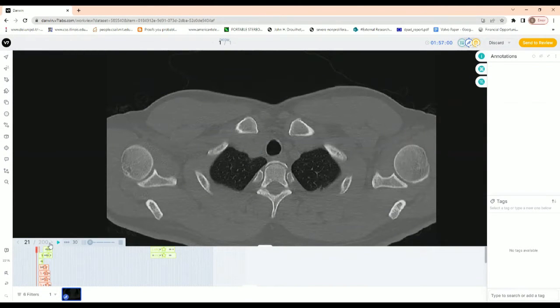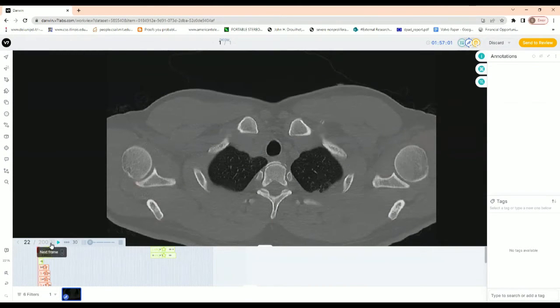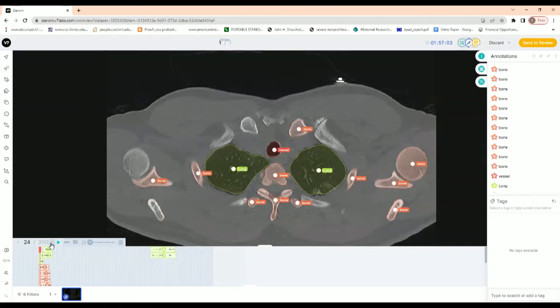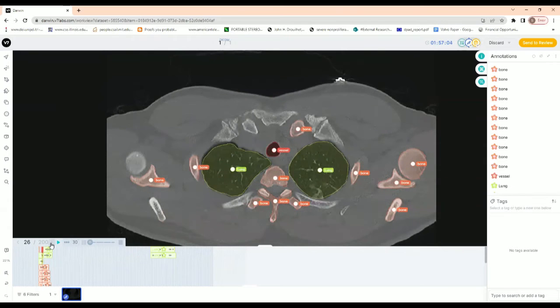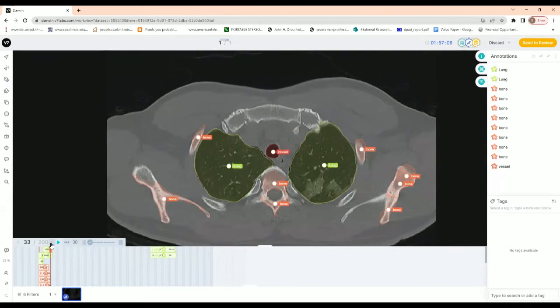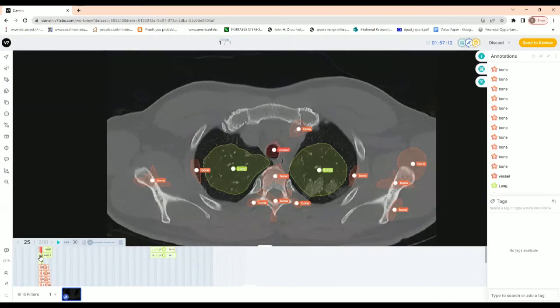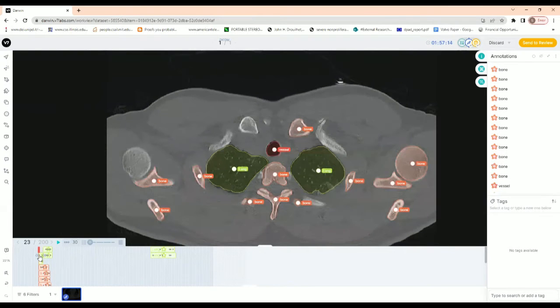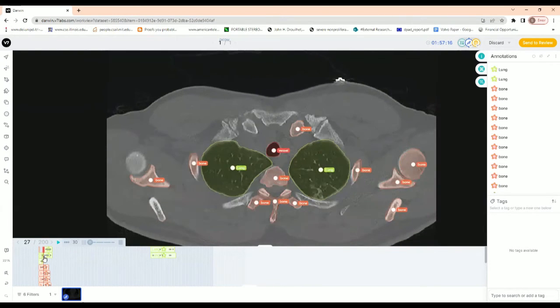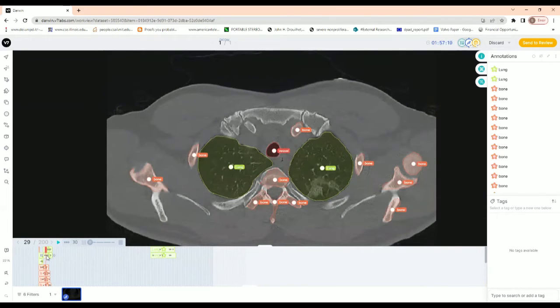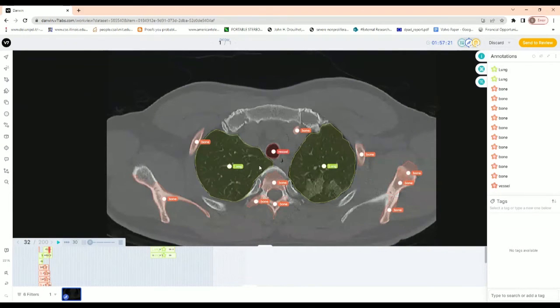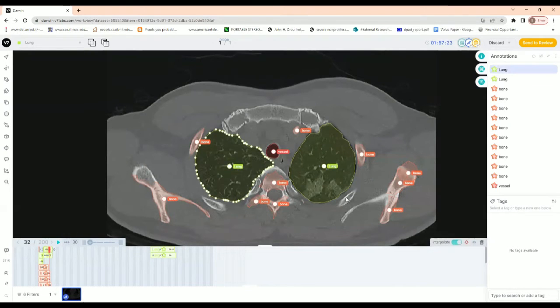Once the annotations have been done — this is about after 40 minutes of annotating — you will see that you are now able to get frames 20 to 35, so about 13 annotated frames. As you can see, there are multiple areas and multiple regions of interest. These annotations are carrying over from one frame to the other because of the interpolate function.